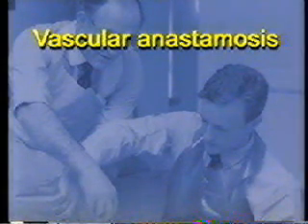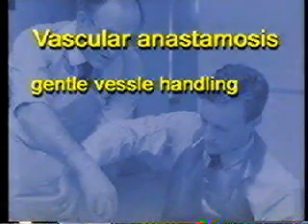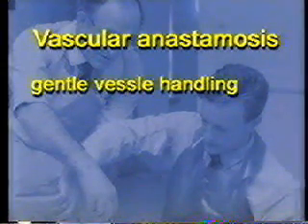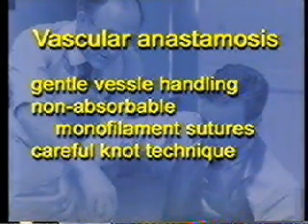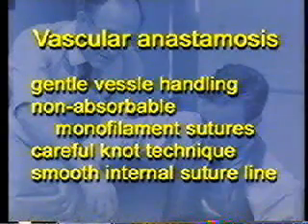Anastomosis requires very careful and gentle handling of the vessels. They also utilize non-absorbable monofilament sutures with a very careful knot technique. Several throws are needed for each knot. A smooth internal suture line is essential.